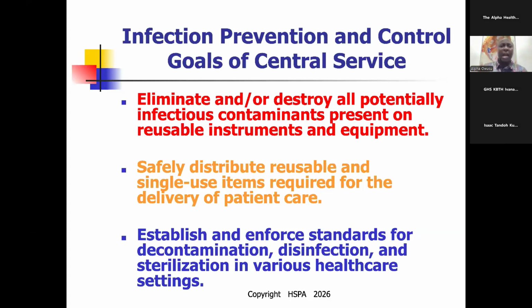How we decontaminate items from point of use treatment, coming to the decontamination area, cleaning, using the cavitation process, right? Where instruments are difficult to clean, we use the cavitation process or ultrasonic to clean them, right?